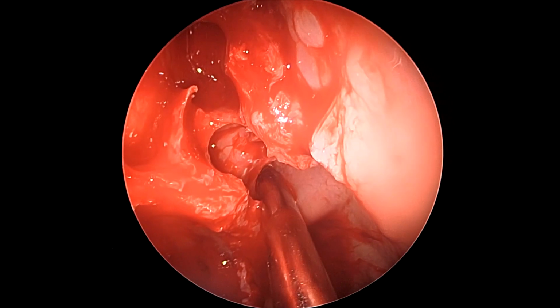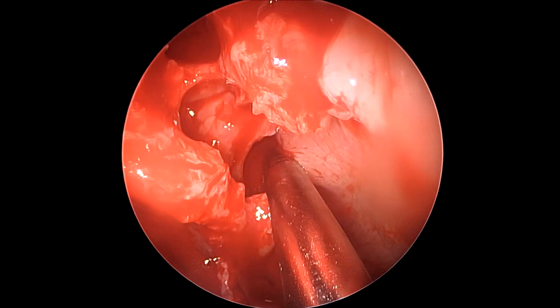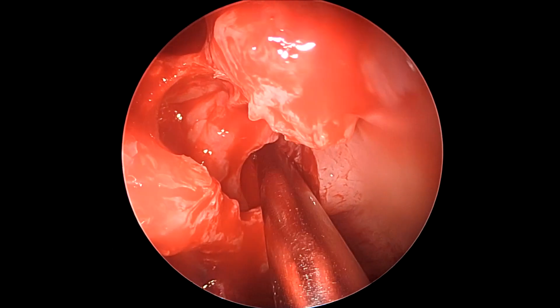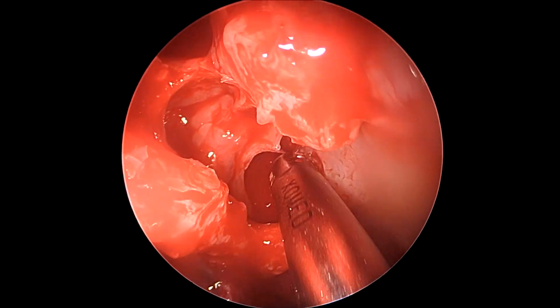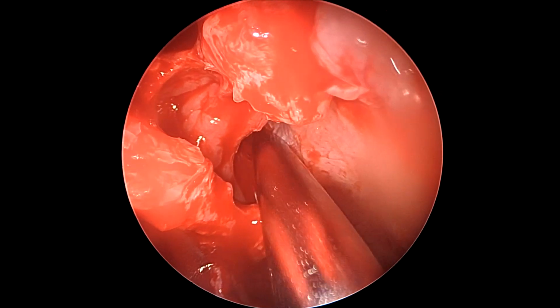Now as we go medially towards locating the sphenoid sinus, as you see there, we have just entered the sphenoid sinus, which is normally located medial to the middle turbinate inside the sphenoethmoidal recess. And as you see here, one can again orient how the entry into the sphenoid sinus or the sphenoid os lies literally at the same level as the horizontal antrostomy ridge.